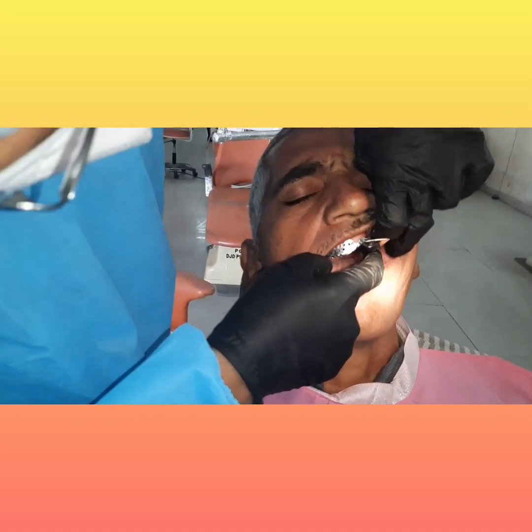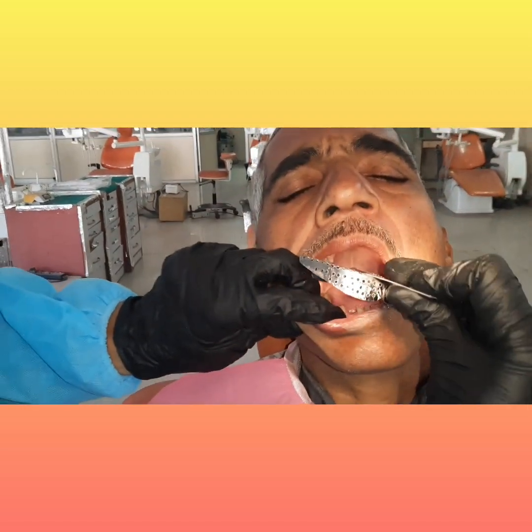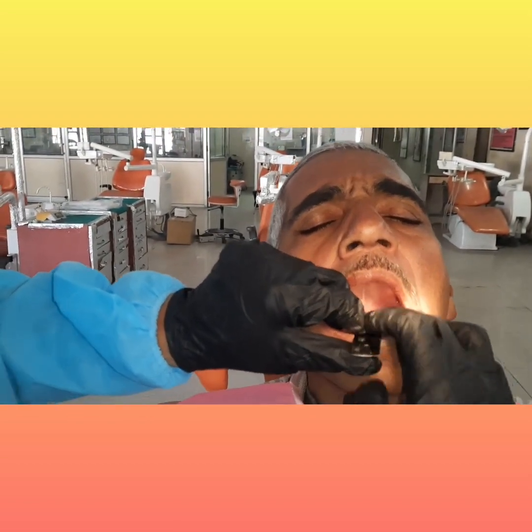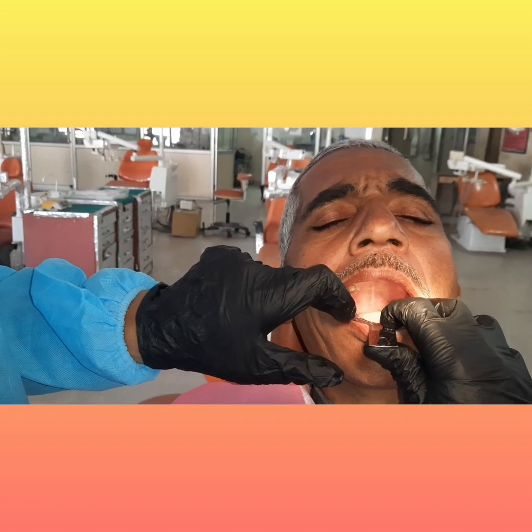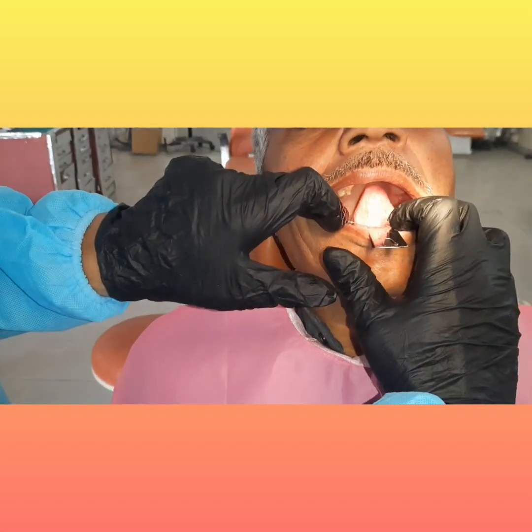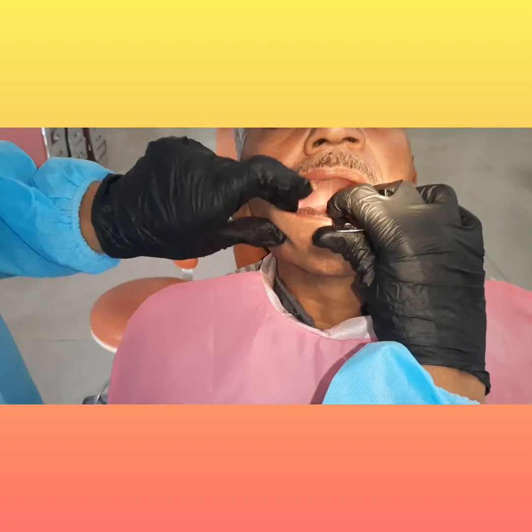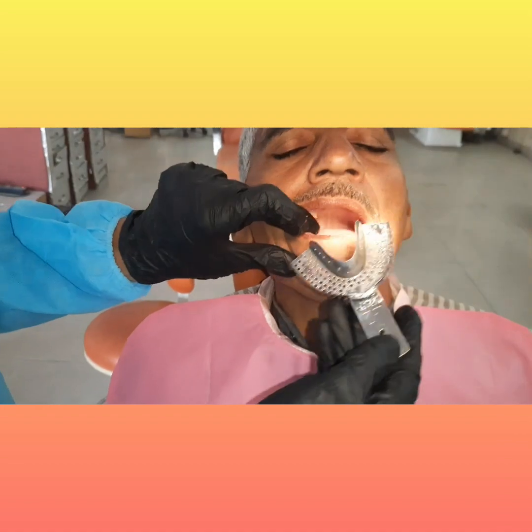You need enough space for the material to come in. So you select the U1 tray, U2 tray, and for the lower, again you have to follow the same thing — all the teeth are covered. Ask the patient to make tongue movements and make sure the patient can do so when selecting the tray. This is the L2 tray.